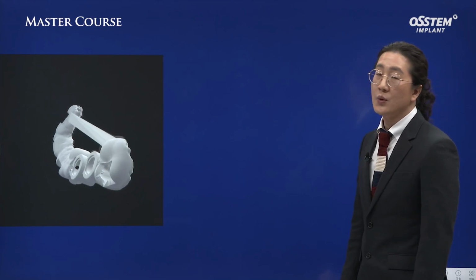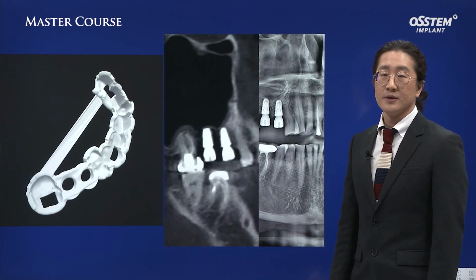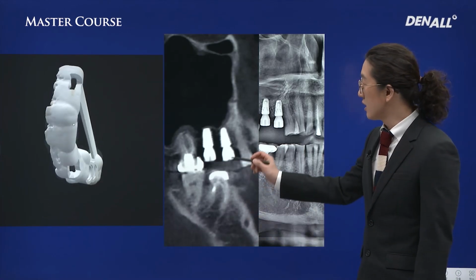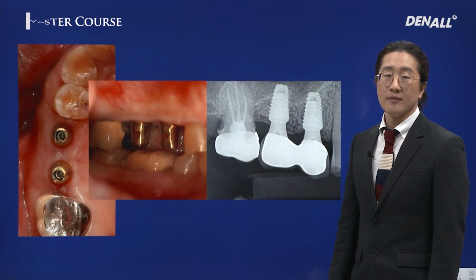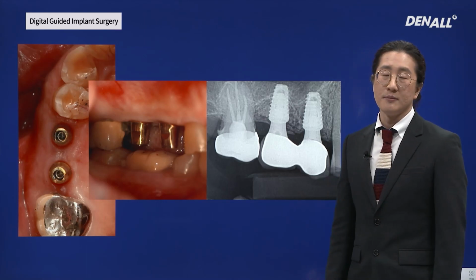Surgery was performed using the fabricated guide. On the CT, you can see implants have been positioned nicely. In this case, a crestal approach was used and prostheses were delivered.